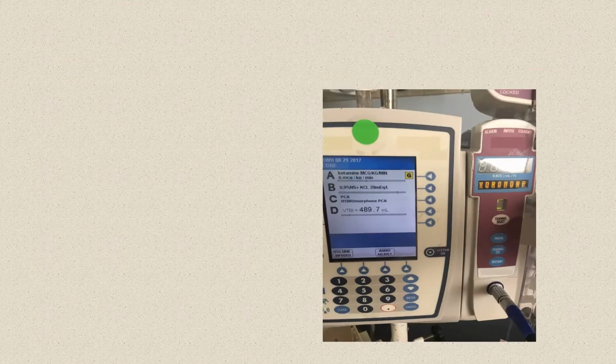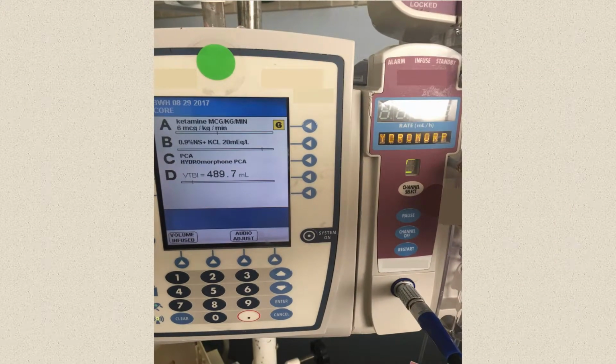Now that we know what the available information is and have a sense of the questions that often need answering, we'll next go over how to actually get all the critical information from the pump. This is the PCA module attached to the infusion pump brain. This is just one of a number of types of PCA pumps that exist in the world, and obviously the one used at Brigham and Women's. If you're from outside the Brigham and you have a different pump, you'll need to check with your local experts to determine what information you can get and how.